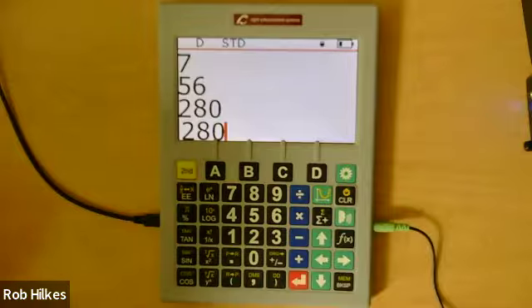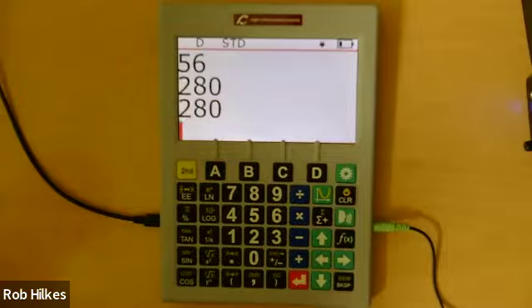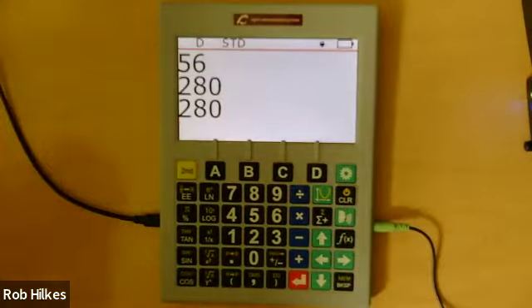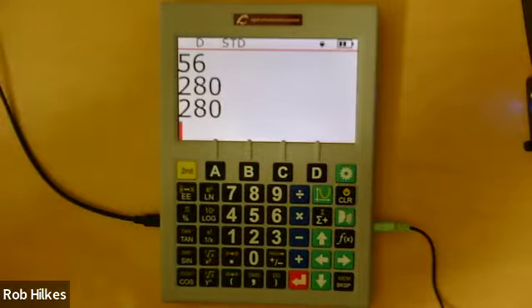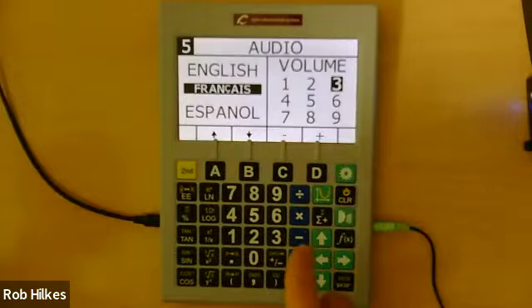Leave well enough alone. Oh, there it is. Entrée 280. Does that sound better? Yeah, that sounds a lot better. Okay, so I'm going to take my headpiece off. And I guess I should put it back into English.